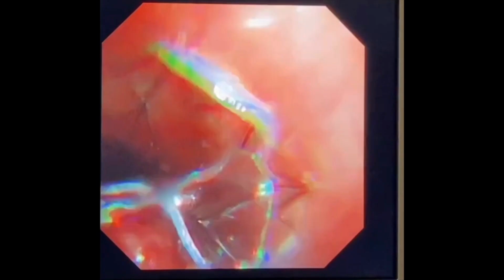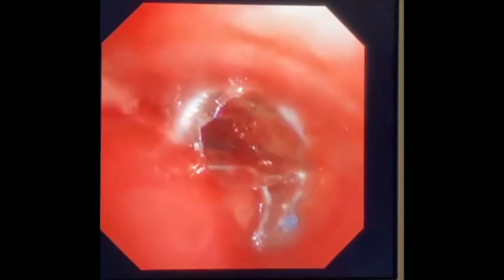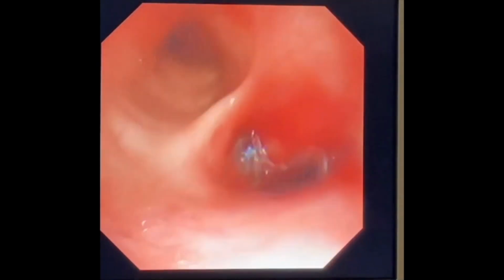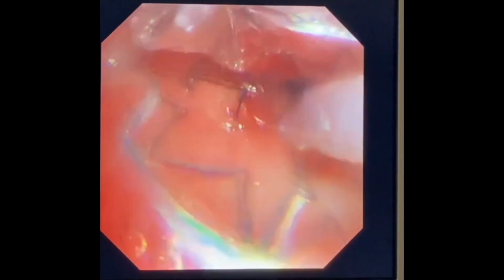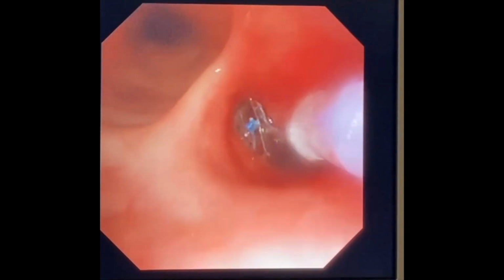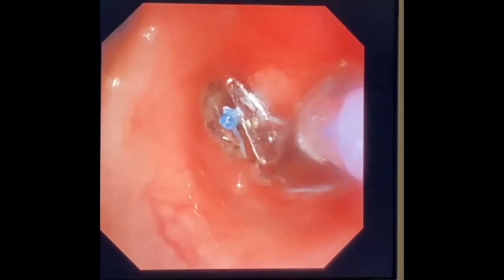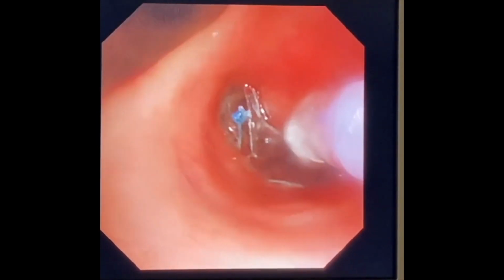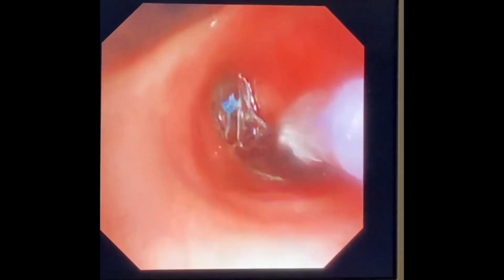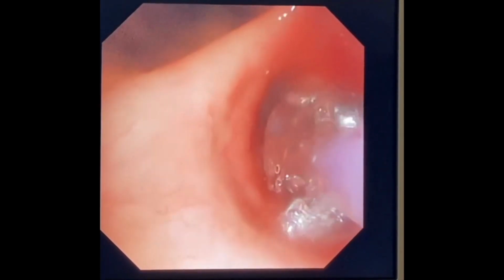This is a nitinol self-expanding metal stent with a PTFE covering and has one of the strongest radial forces on the market. However, you can see the tumour itself is causing the stent to buckle, and in this case we are using a 12mm balloon that we are passing into the lumen of the stent so we can give it a little helping hand to open up.